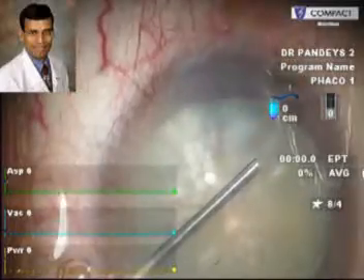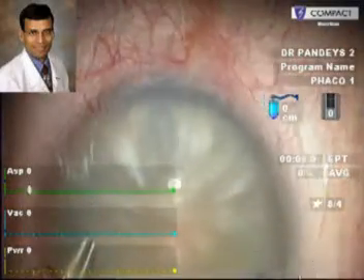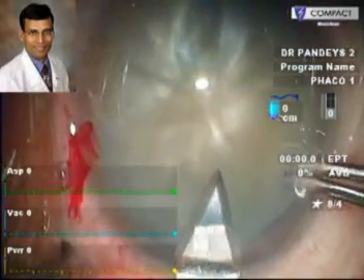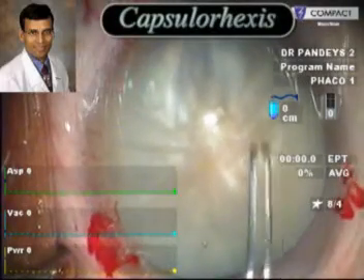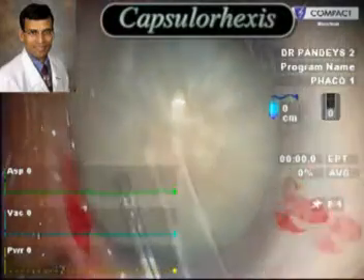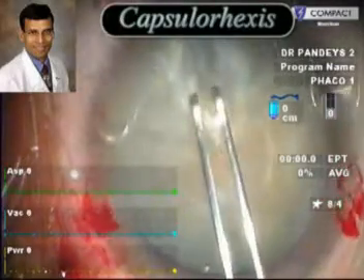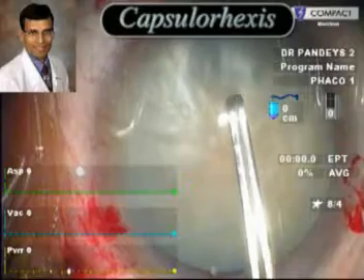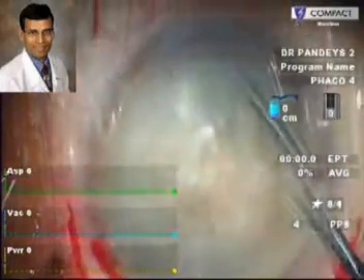This is a moderately hard cataract and here, this is the routine phacoemulsification being performed with the main incision at the steep axis as you can see here. A capsulorrhexis is done followed by the hydro procedures. The phacoemulsification is then performed as usual.